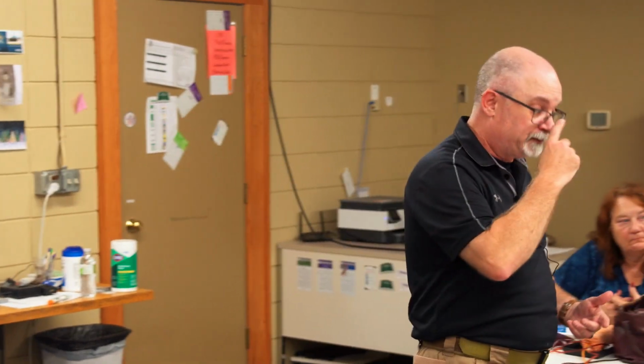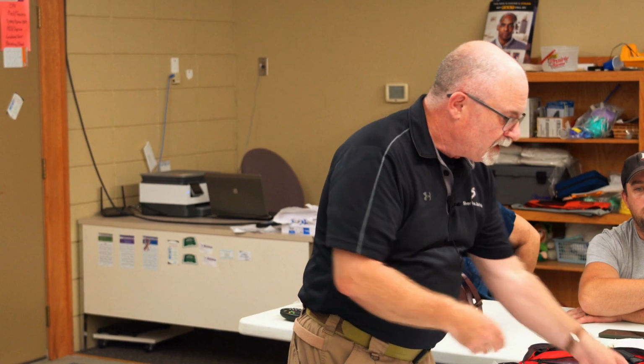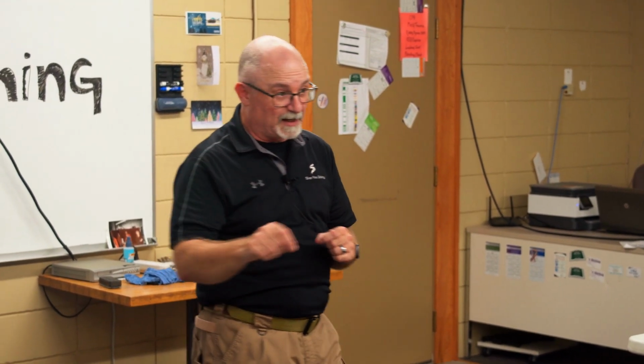So go ahead. The difference between the two, like body type, age, would you use one or the other for one or the other? Yes and no. Mostly it's going to be, well, you use any port in a storm. Sometimes that comes into play. So maybe all you can get is a 22, but it's going to be in the AC, which is plenty that would be able to handle that.